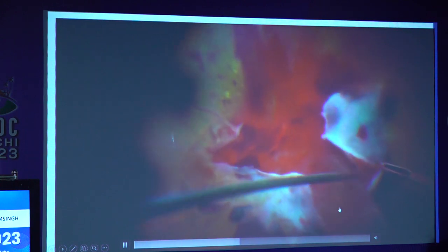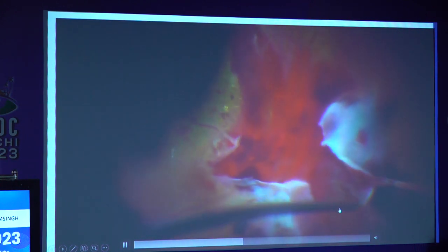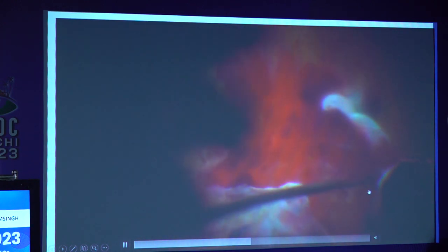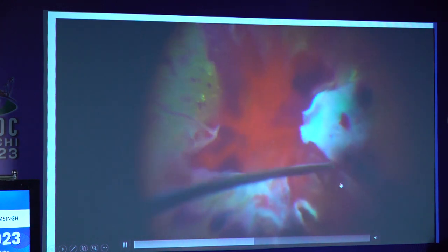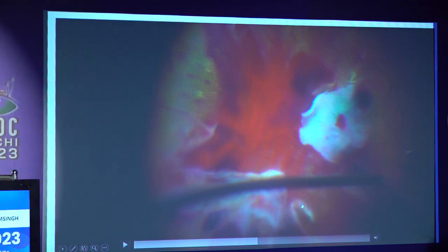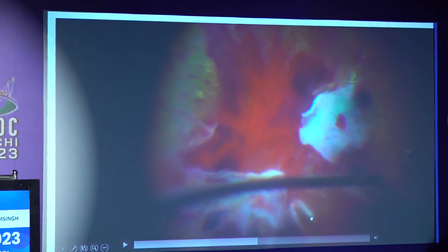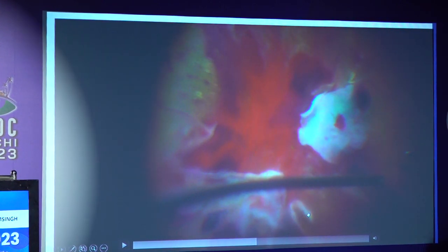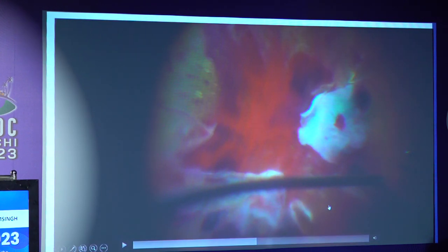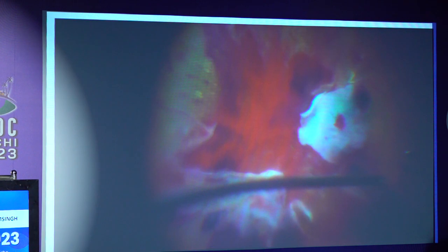So, you see a gush of blood coming. And when you see excessive bleeding, I think you suspect that you have created a tear. And this was definitely a very thickly adherent membrane. Now, how do you address it? One is you clear the traction around this. But another thing which I learned in the last few years is to diathermize the edges of this iatrogenic tear if you get it in PDR. Because the last thing you want in PDR is a subretinal bleed. We were all dreaded and worried about vitreous cavity bleeds, but subretinal bleeding is even worse in PDR cases.